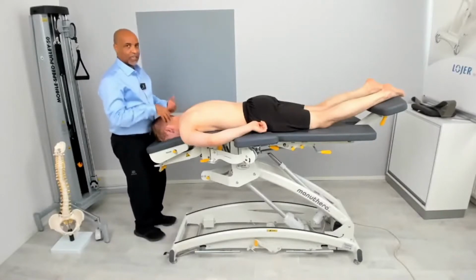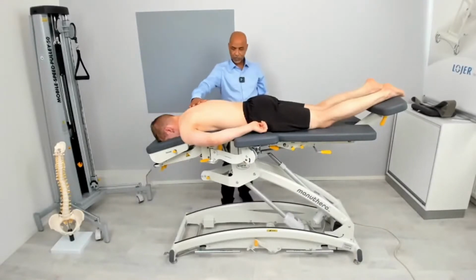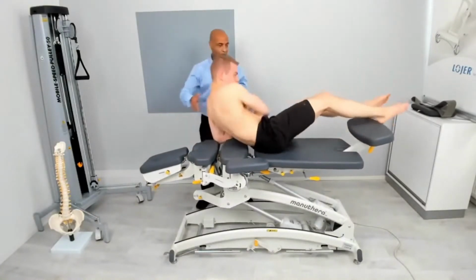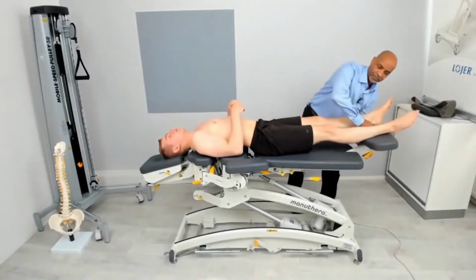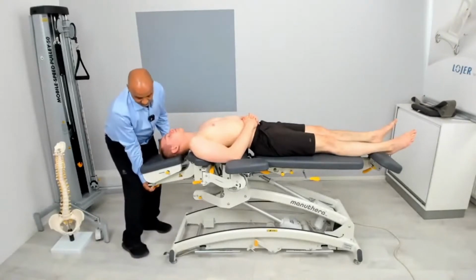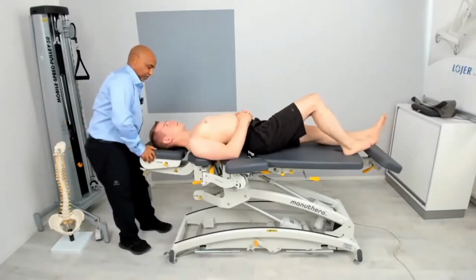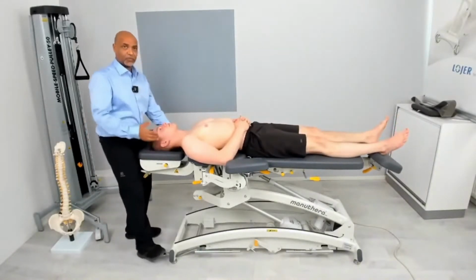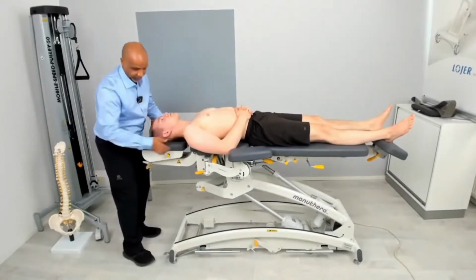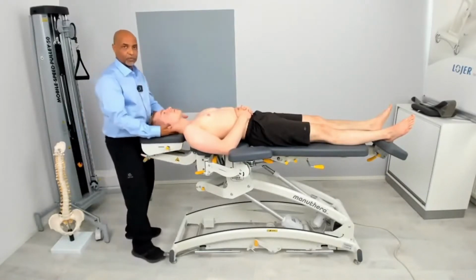Now I'm going to demonstrate the other way to do it, in the opposite direction. So I will request this gentleman to turn around and lie down on your back. Again, it's very important to make sure that whenever you're doing the treatment, the patient is very comfortable. And I want you to come a little bit upward. Yes, so the comfort of the patient has to be treated as a priority also. For example, if you see that there is a little bit of a gap there, I can close the gap and make sure that he is very comfortable in this particular position.